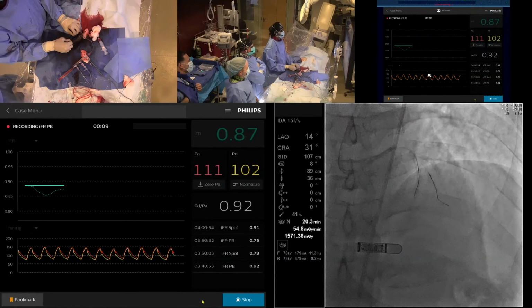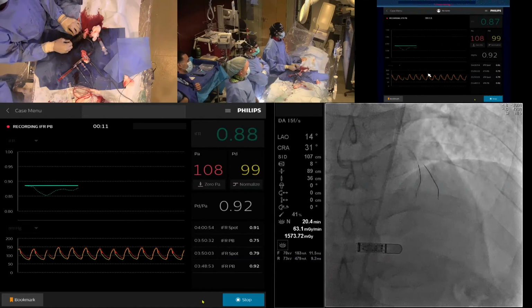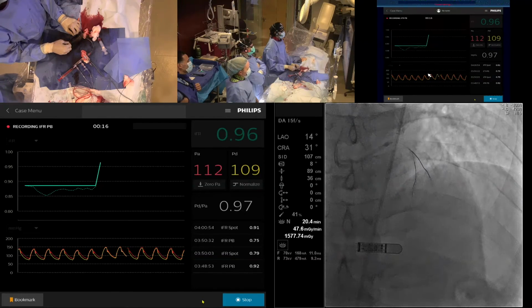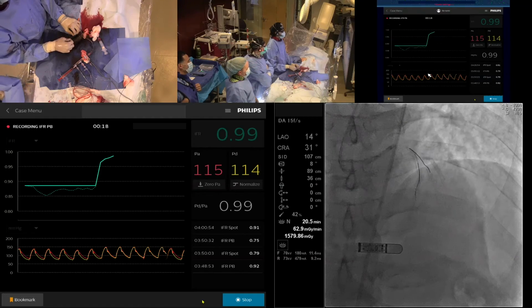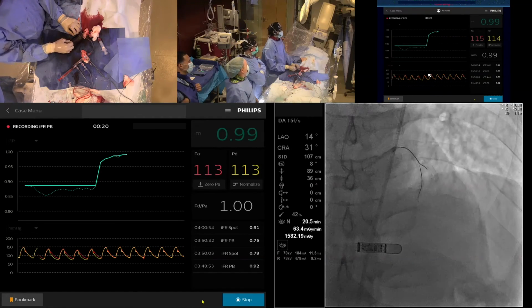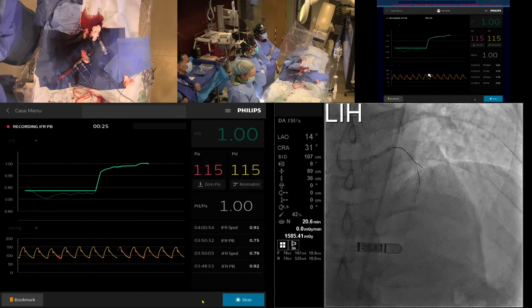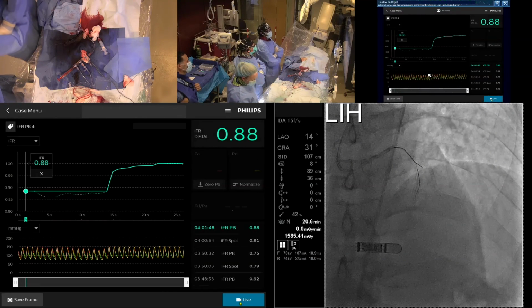All right, so the stent results seem to be good. What'd you expect? Now you see the jump from the proximal lesion, right? It's exactly the same jump as we had before. So it's not nothing, but I think it's not significant enough. It's certainly not worth going to make a bifurcation PCI out of. No way. Right.